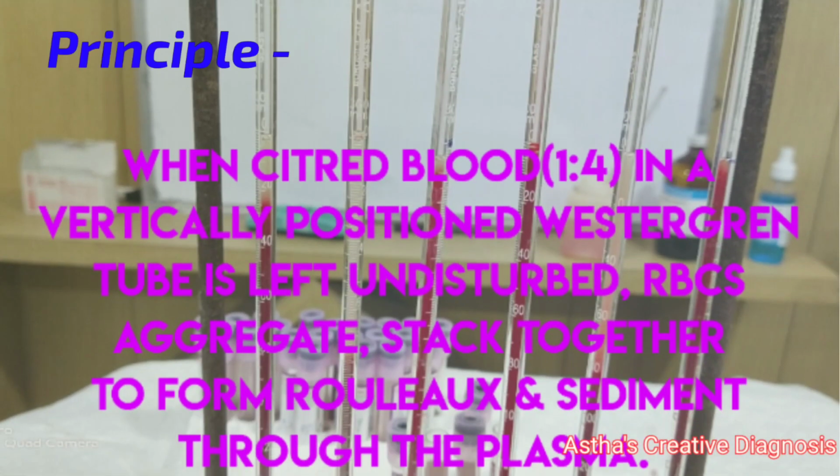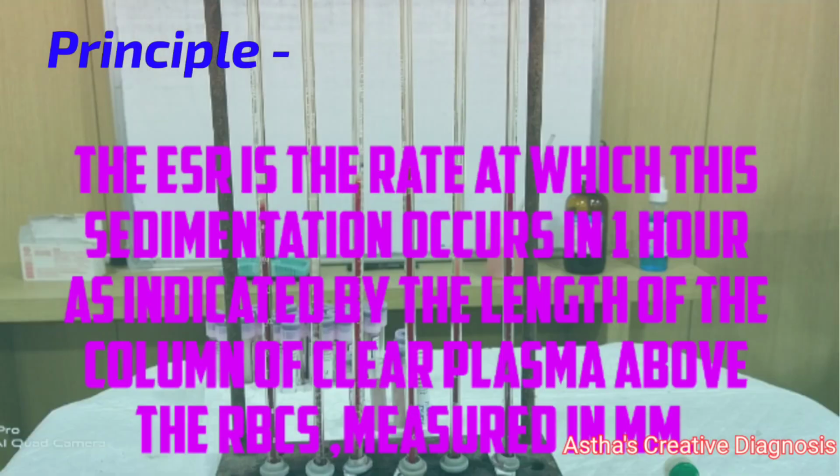Principle: when citrated blood at 1:4 dilution in a vertically positioned Westergren tube is left undisturbed, RBC aggregates stack together to form rouleaux and sediment through the plasma. The ESR is the rate at which this sedimentation occurs in 1 hour, as indicated by the length of the column of clear plasma above the RBCs, measured in millimeters.